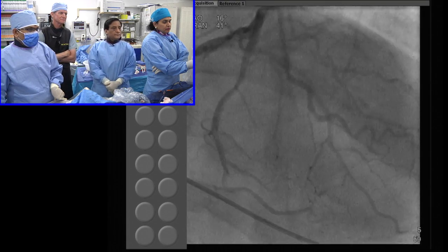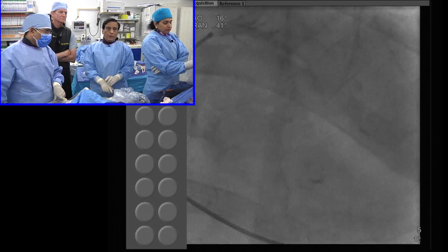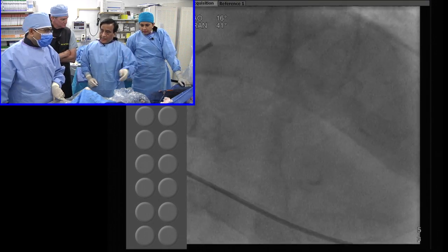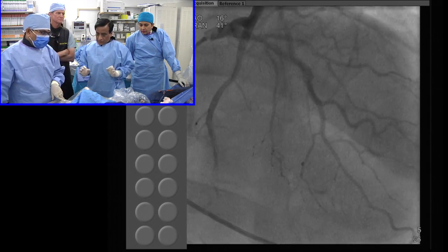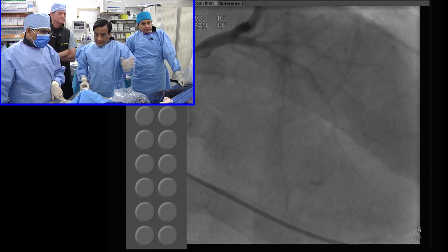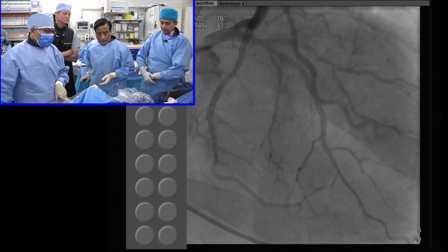Anu? Samin, quick question before you proceed. Any plans for the circumflex in the future? Yeah, well actually as we saw, the stress echo was only anterior wall and they did an FFR of the LPL which looks quite tight to me, but it has been done and is 0.87. Okay, so we leave it alone. We leave it with this patient who has just minimal symptoms. He has a mild AS anyway, so he will be followed very closely for progression of both his aortic stenosis as well as CAD.